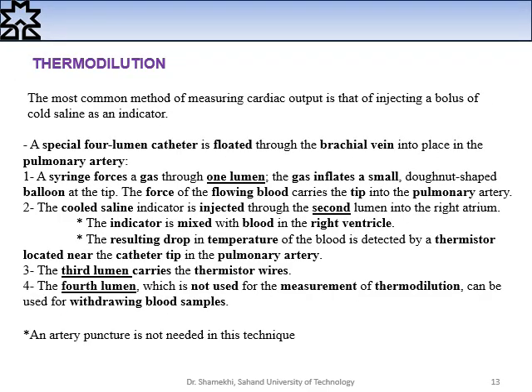Thermodilution is the most common method of measuring cardiac output. It involves injection of a bolus of cold saline as an indicator. I think this is the simplest way to have an indicator.